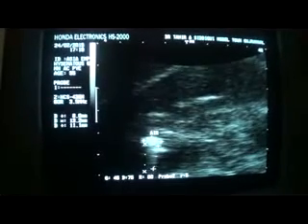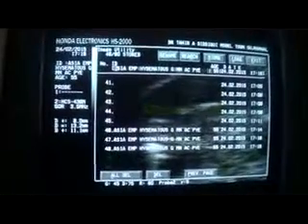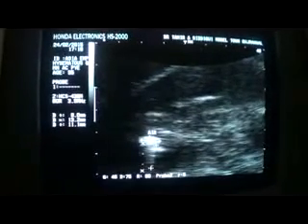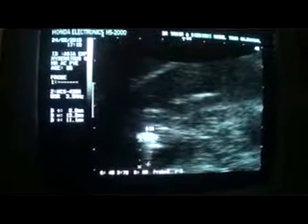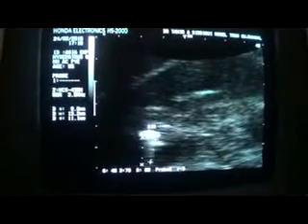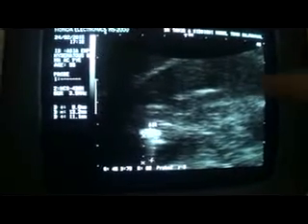Which raises the possibility of emphysematous pyelonephritis, that of the left kidney. Few other echogenic particles are seen, but here the focus is the upper pole of the left kidney.